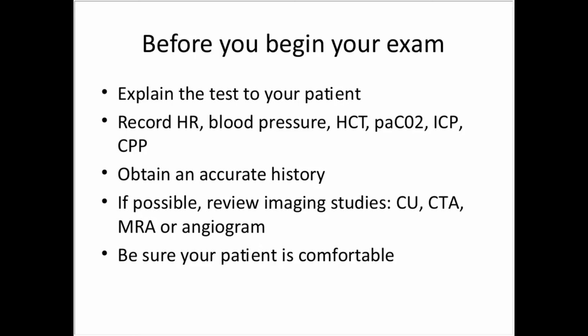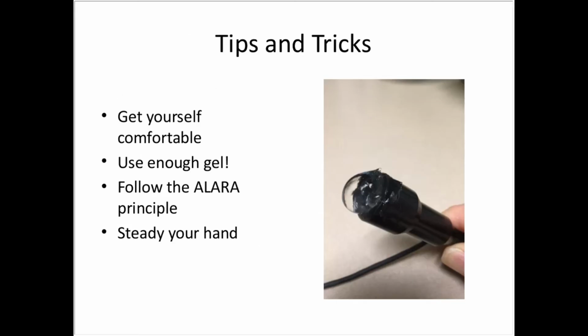It's so important to obtain an accurate history. And if possible, review imaging studies such as a carotid duplex, CTA, MRA, or angiogram. Be sure your patient is comfortable. And get yourself comfortable. Use enough gel on the probe. Follow the ALARA principle, which is as low as reasonably achievable.